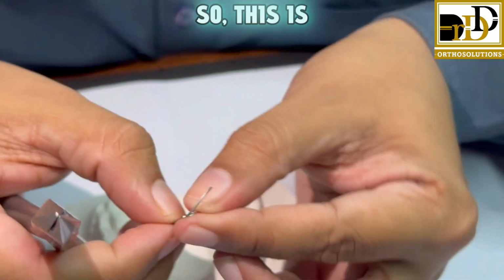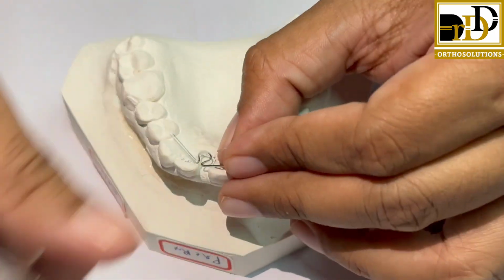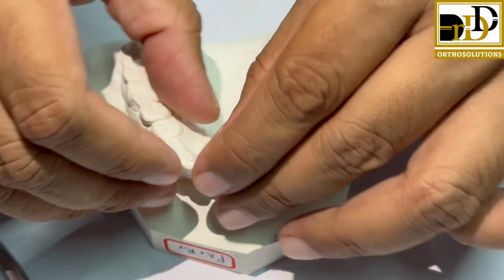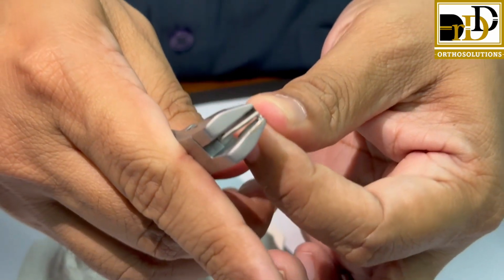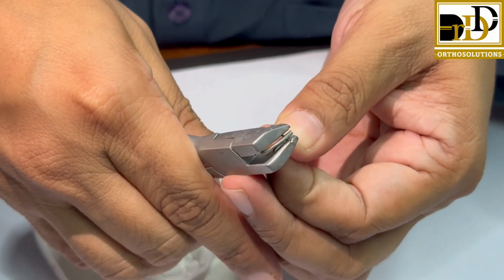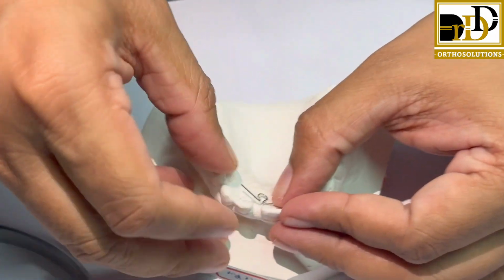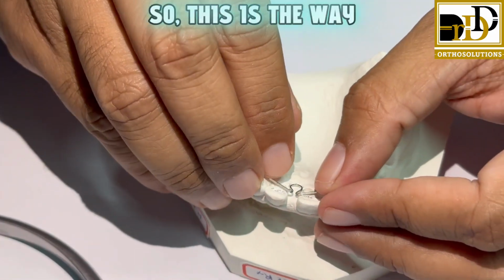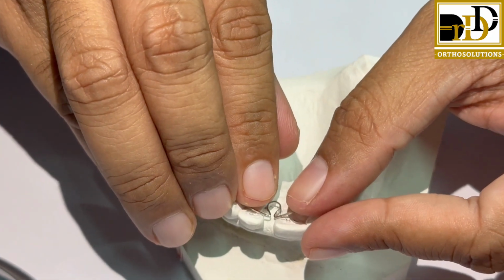So this is the way the loop will be finally engaged.